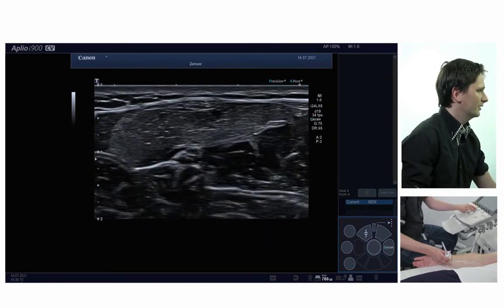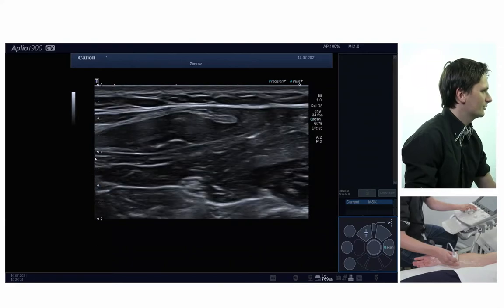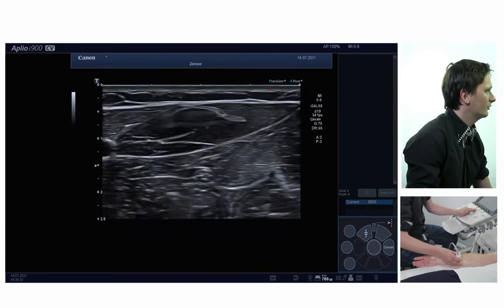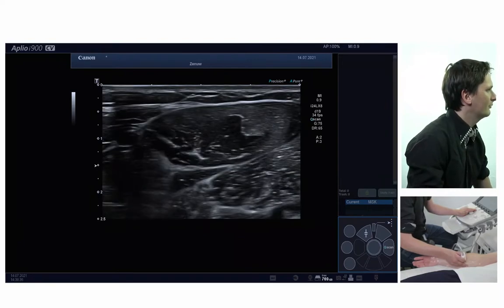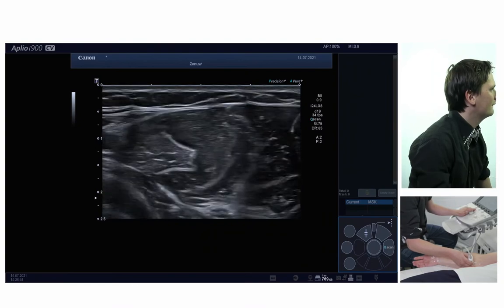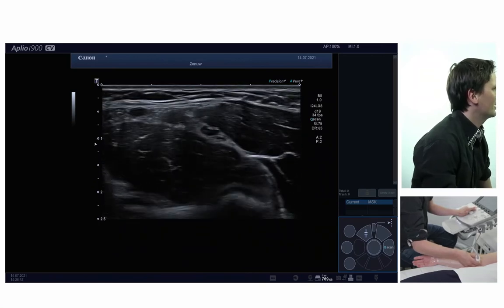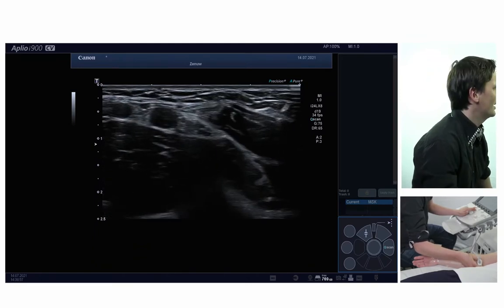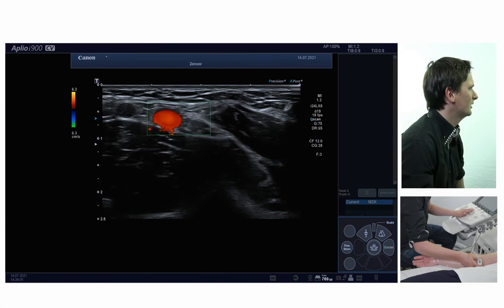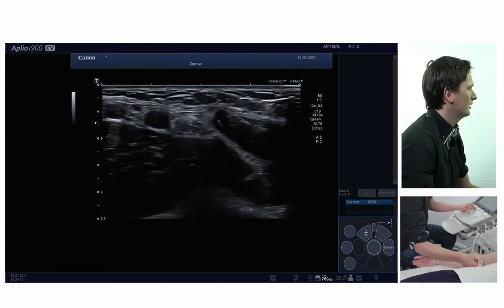Still in the forearm, the nerve runs between the superficial and profound flexor digitorum muscles. Let me adjust the depth because the nerve will be in a less superficial position. Here we can follow the nerve all the way into the depth, and then over here it will go to the surface again between the two bellies of the pronator teres muscle. Here at the elbow you see one of the main landmarks — the brachial artery — you can see it pulsate, and with color Doppler it gets even more clear. Right next to it is the median nerve.